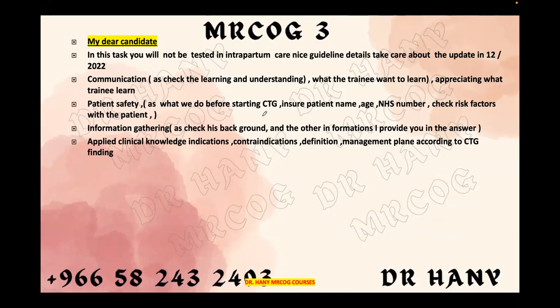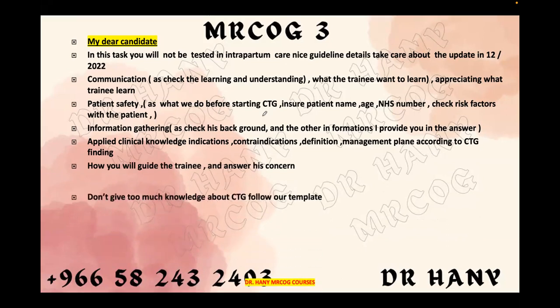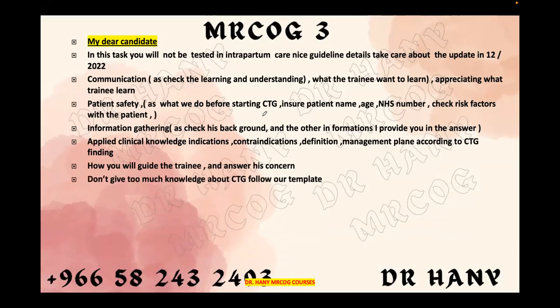In my exam, it was a normal CTG. In another exam, he may give you a suspicious or pathological one, so the action will depend on what is in front of you, and how you guide the trainee to answer his concern. Don't give too much knowledge. Give it in chunks and ask. About the CTG, follow this template, or the approach we have used.